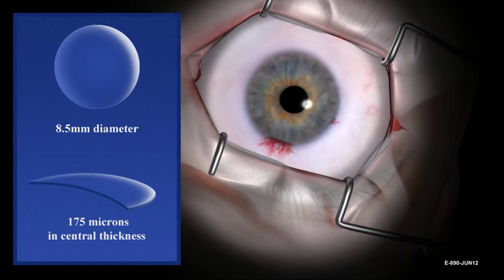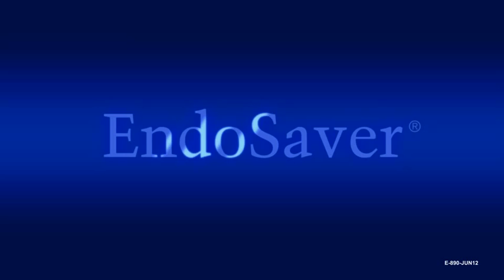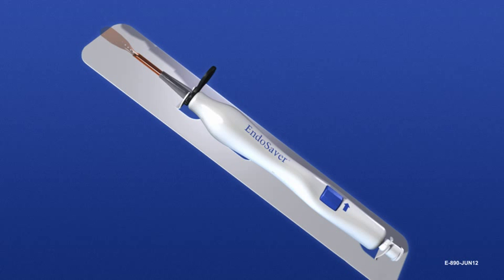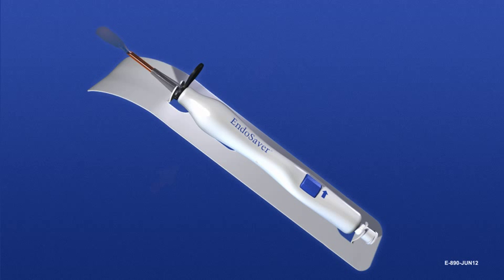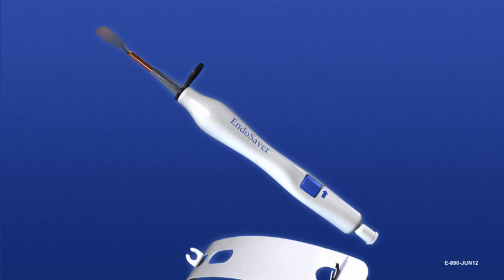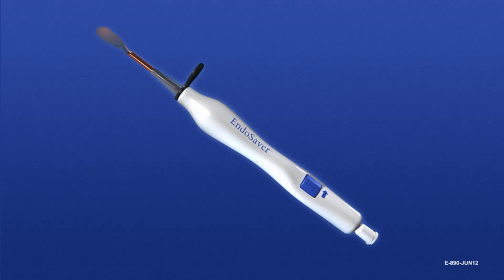The following information provides instructions for the use of the EndoSaver during endothelial keratoplasty procedures. Open the package and handle the device using standard sterile procedures. Hold the device by the body and remove the white plastic platform card by gently pulling it down and away from the carrier end of the device. Do not remove the black locking guard from the EndoSaver until ready to insert tissue into the anterior chamber. The device is delivered with the amber-colored allograft carrier already extended in the loading position.